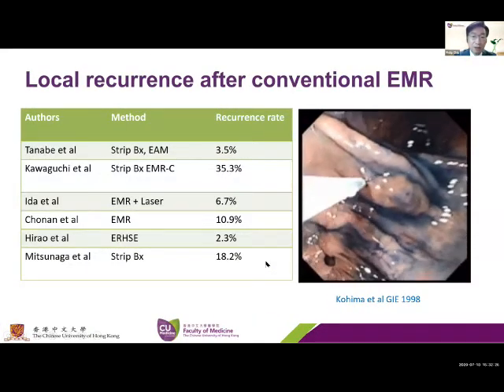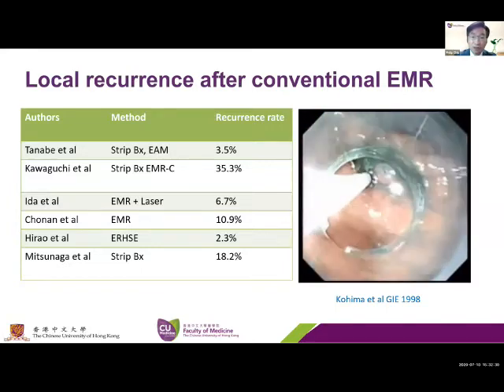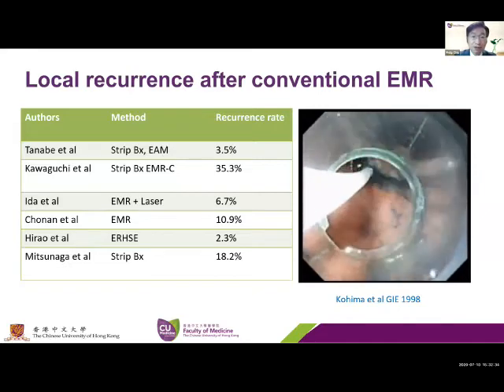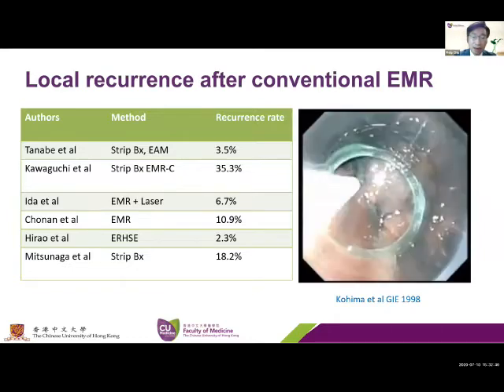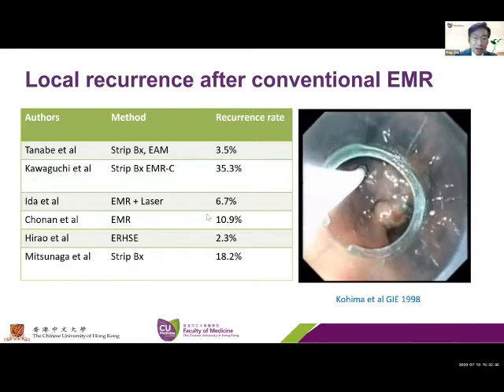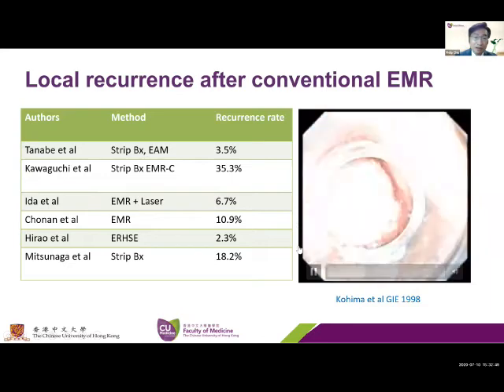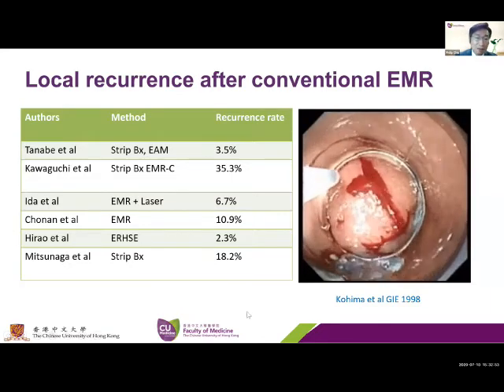In the past, we have developed numerous methods to achieve endoscopic resection, ranging from polypectomy to EMR. EMR was specially developed to address the treatment of early GI cancer, pioneered by our Japanese colleagues. The technique is a modification of polypectomy, with the application of a snare after injection, and also the cap EMR.